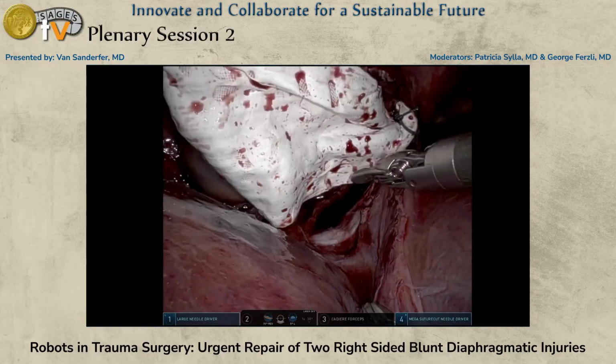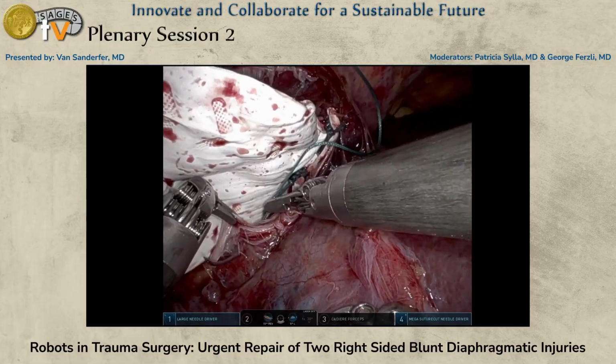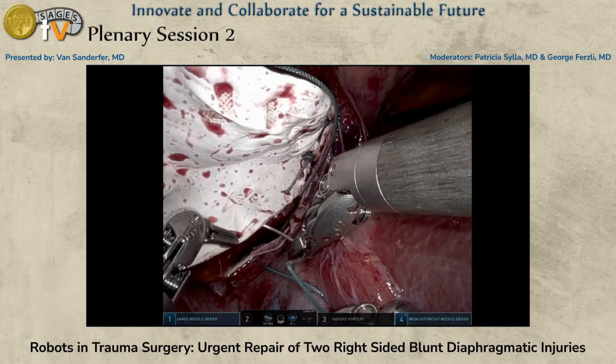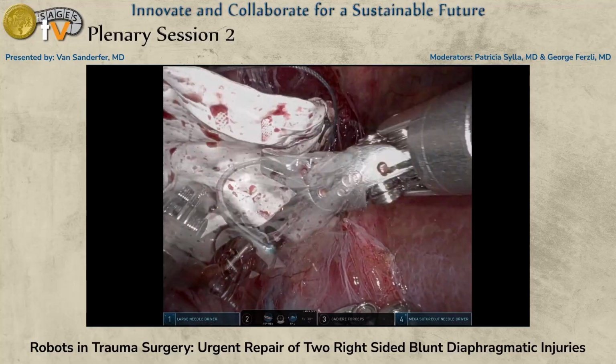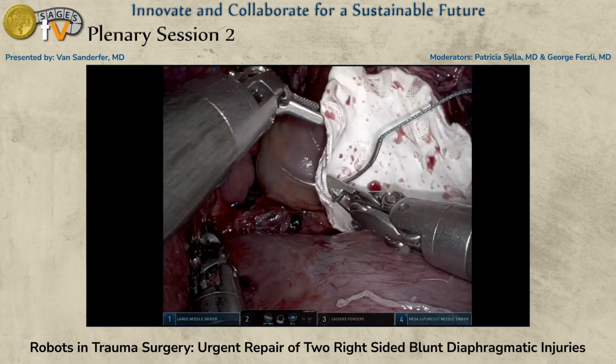The decision to close the pericardial defect was to prevent future complications of cardiac herniation with strangulation resulting in potentially fatal arrhythmias, myocardial ischemia, or cardiac arrest from acute disruption in preload.